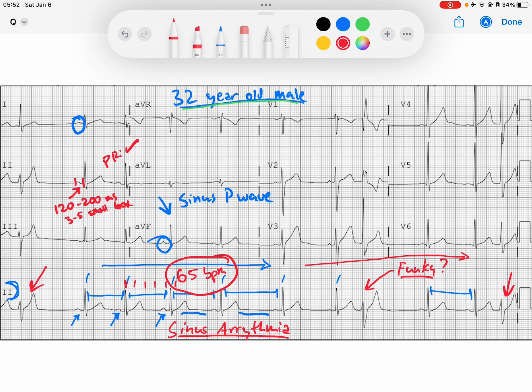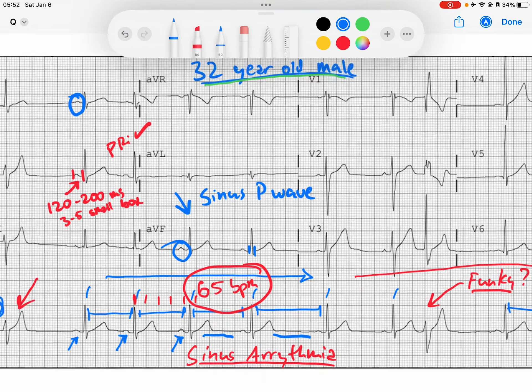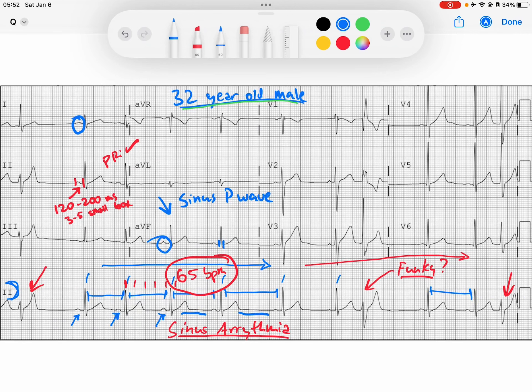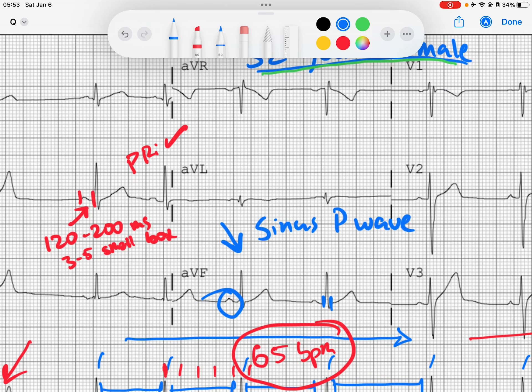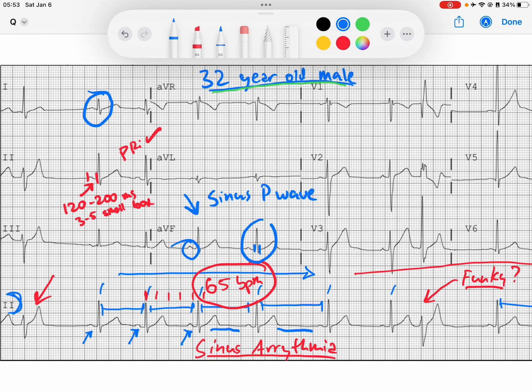So we've got sinus arrhythmia and narrow QRSs. Let's completely evaluate our QRS. I've got a narrow QRS. Looking at my normal QRSs, they are upright in lead one and upright in AVF — that tells me my QRS axis is going down and to the left, which is a normal QRS axis. That's what we want.